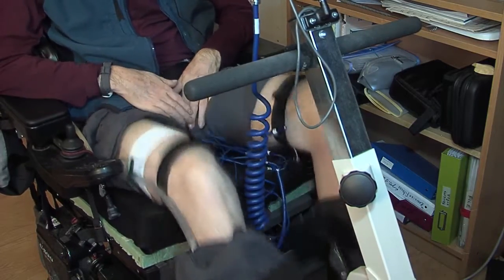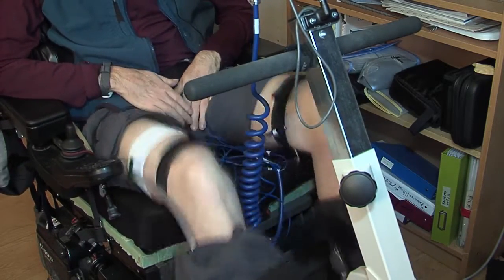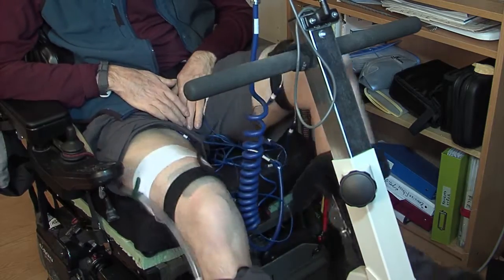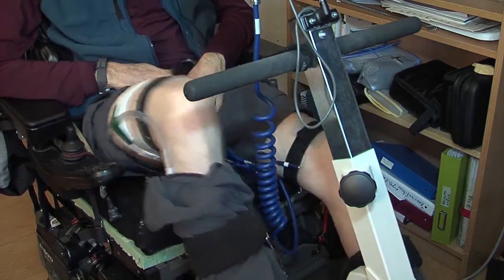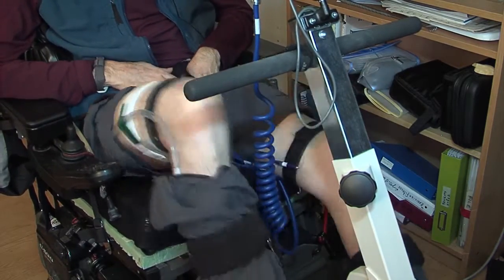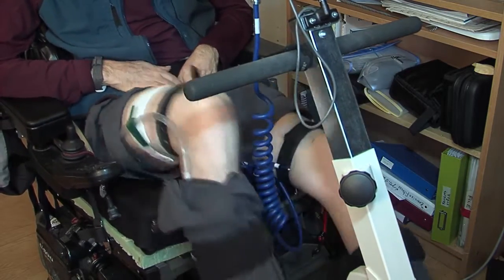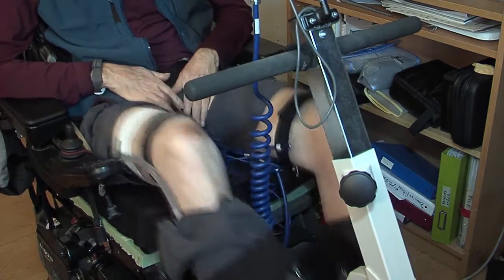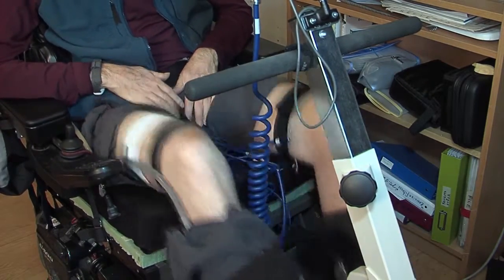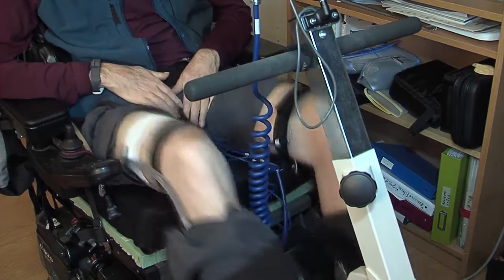Every registered user of this FES bike is registered in a database maintained by the manufacturer. Because of that, I can climb on any FES bike of the same type anywhere in the world and instantly all my settings will be available to me. At the end of every workout, all of the measurements and values recorded during the ride are logged in a database so I can look back over months and see my progress in terms of increasing strength and distance ridden.